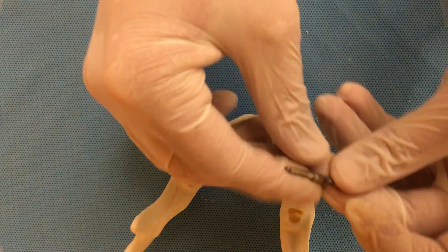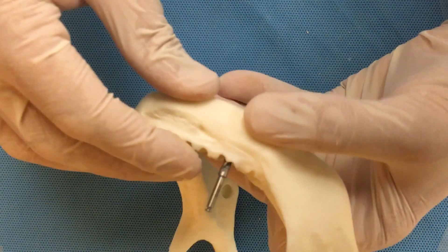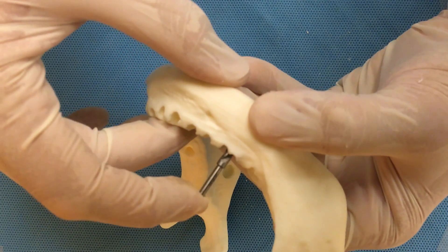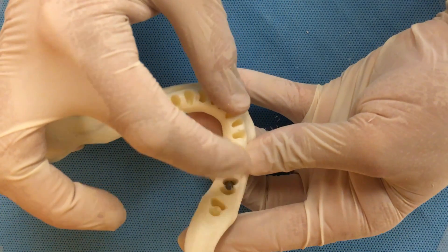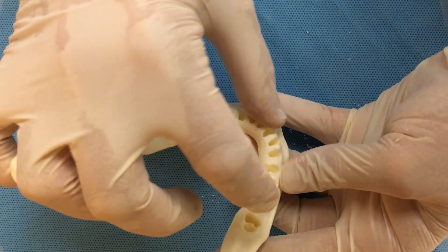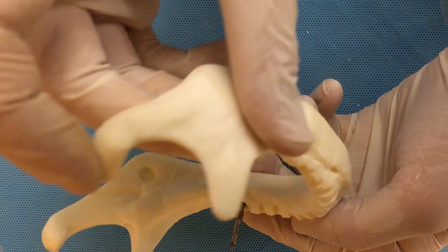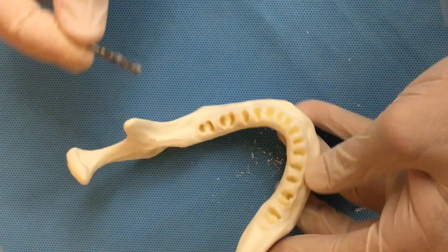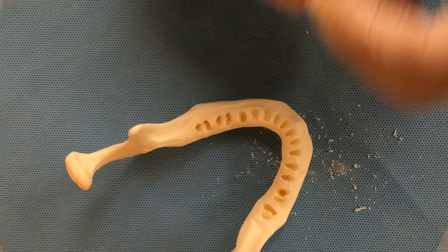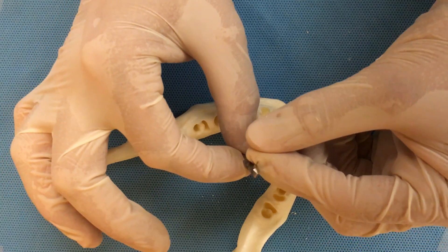We check again if we like the direction of the drilling — 12 millimeters. It's a very stable location and good placement, looking at the occlusal view. Now we increase all the way to 4.2 millimeters, and this is going to be our last twist drill.